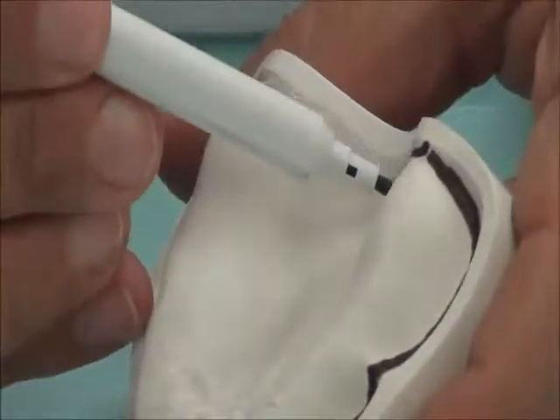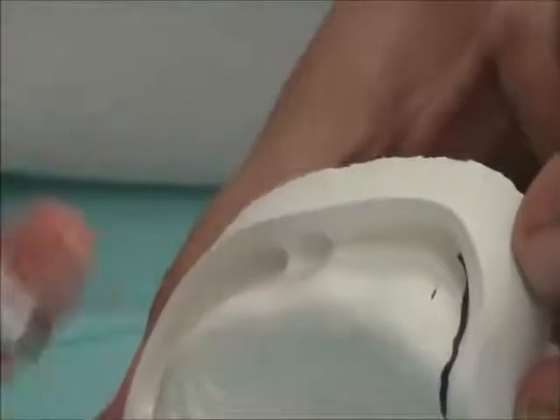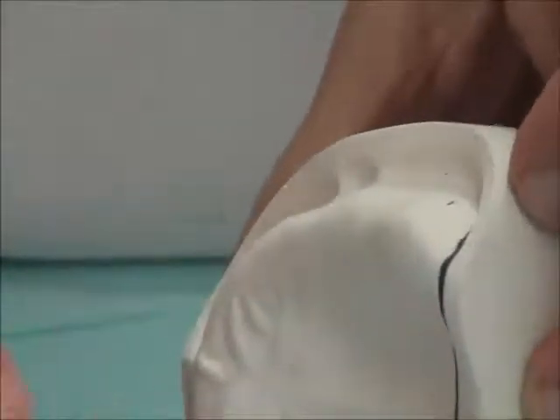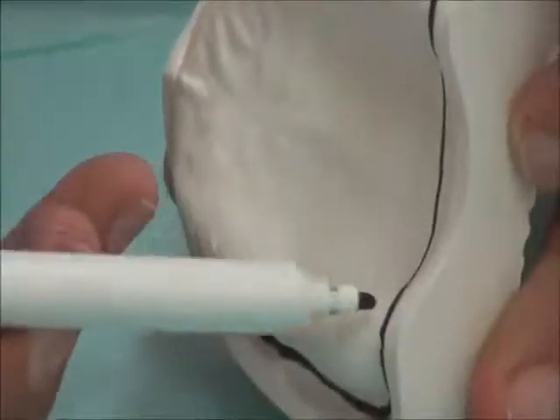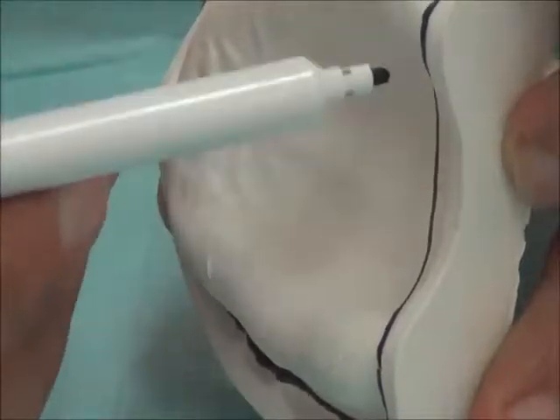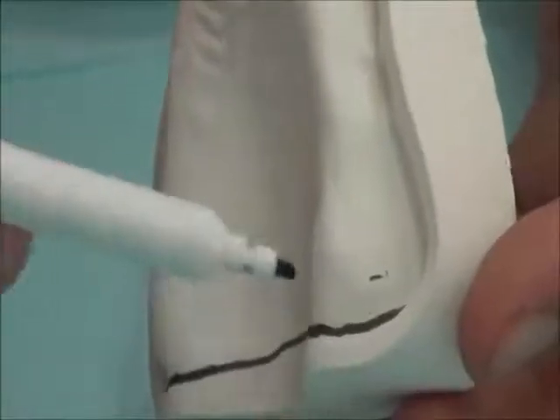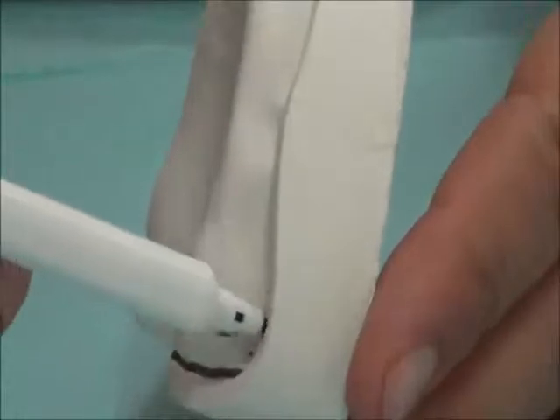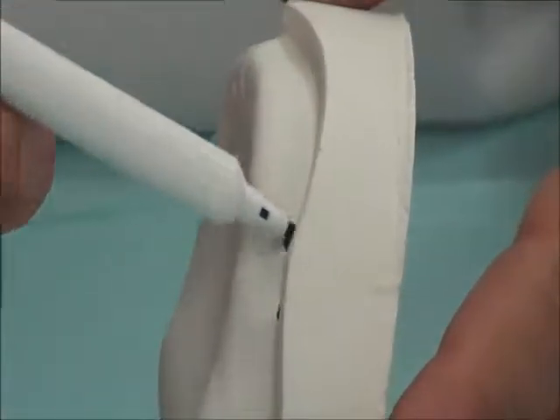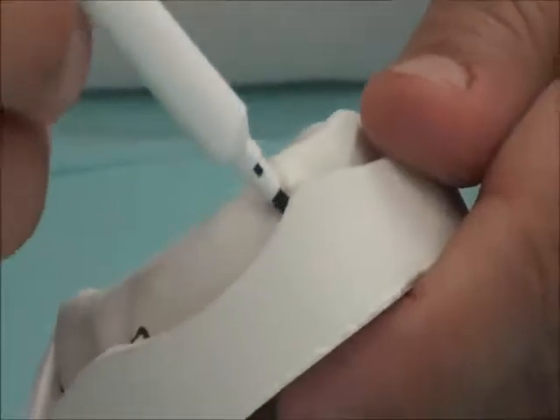From the hamular notch to the hamular notch, for tray purposes, we make it straight, and then we will change it later on. But as a tray, the tray should be extending from hamular notch to hamular notch to record this area, which we will be using for the post-dam later on. We will be talking about that later. So from hamular notch to hamular notch in a straight manner, vertically in the sulci, up and down on the freni area, and going to the labial frenum.